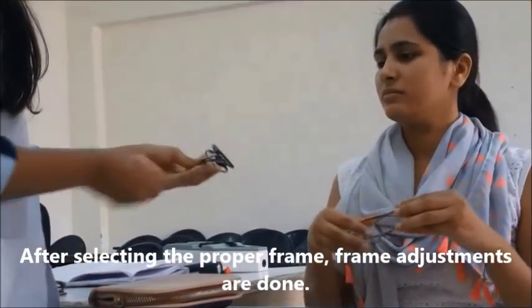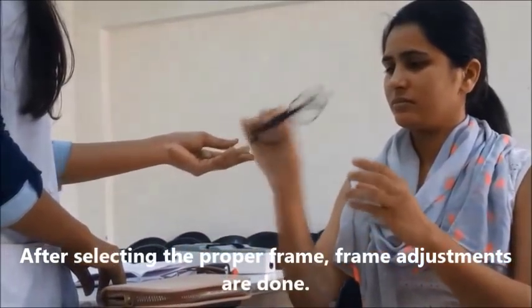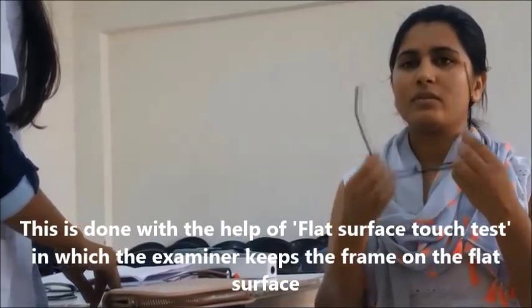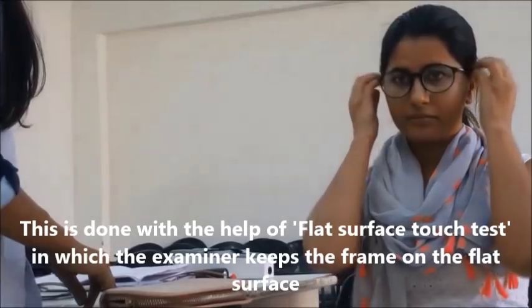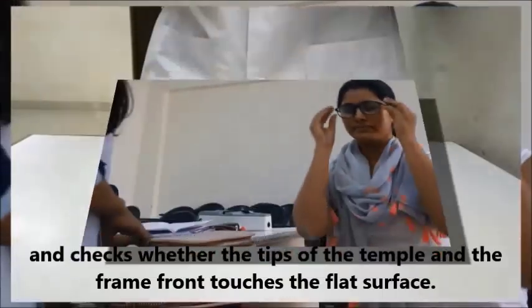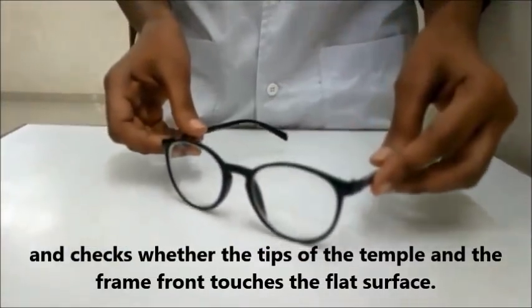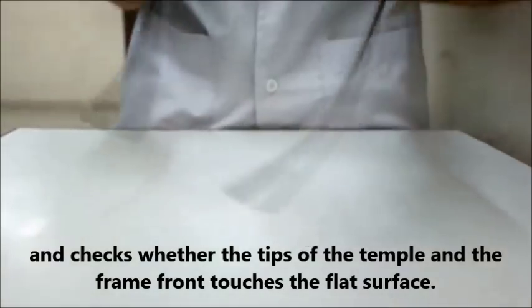After selecting the proper frame, frame adjustments are done. This is done with the help of the flat surface touch test, in which the examiner keeps the frame on a flat surface and checks whether the tips of the temple and the frame front touch the flat surface.